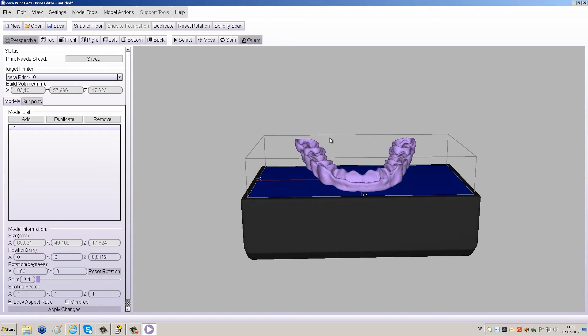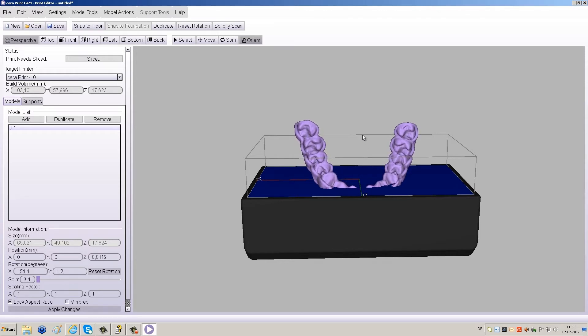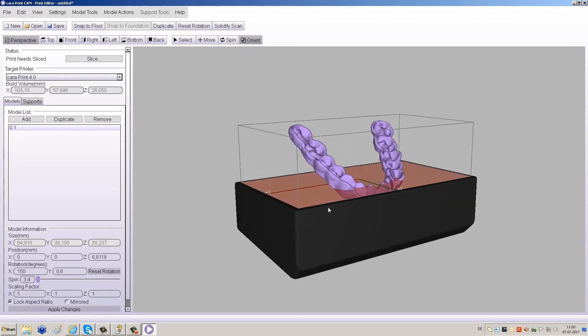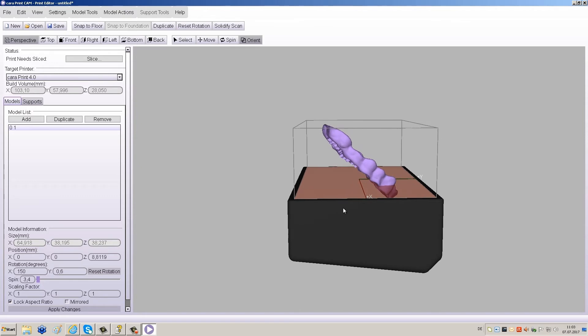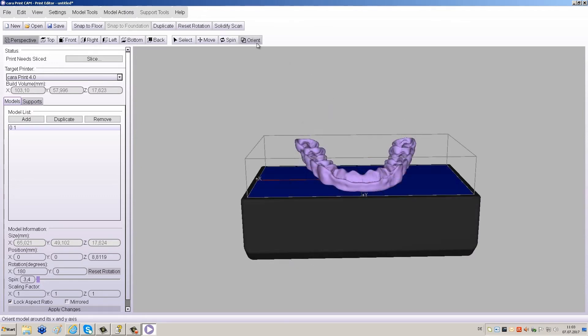To angle the object, click Orient and then click and drag the object to the desired angle. 45 degrees at max is recommended for splints.